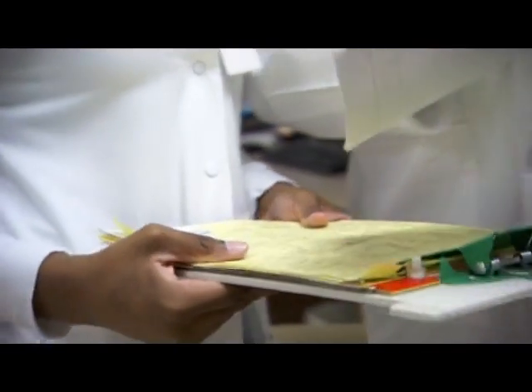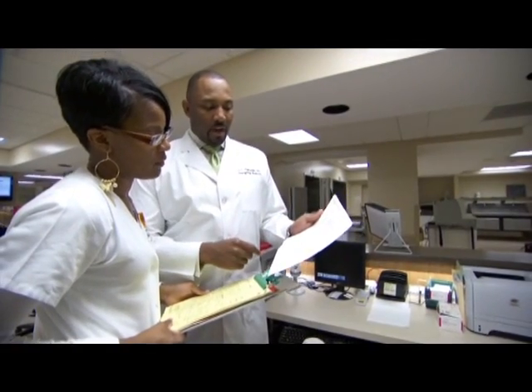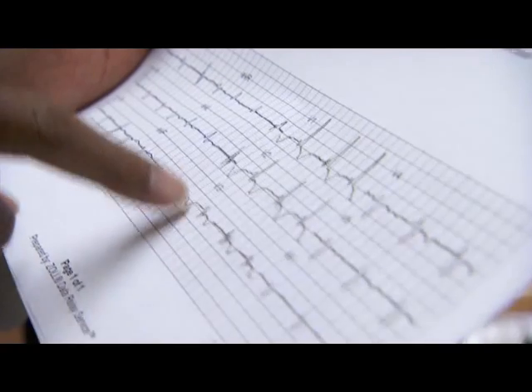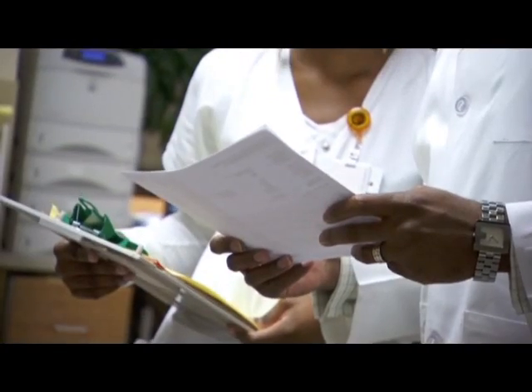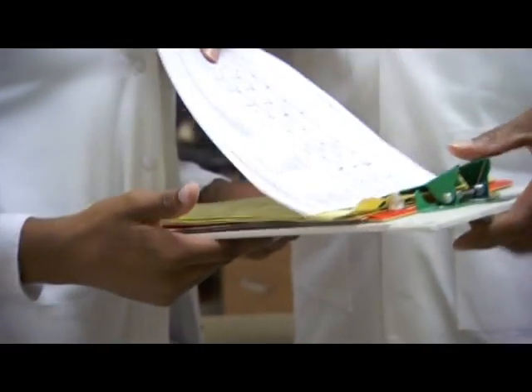As Director of Emergency Services for Baptist Memorial Hospital DeSoto, Dr. Stanley Thompson has worked on the EKG transmission project with the 9 ambulance providers that serve the facility. He says the hospital has cut its time from arrival to treatment to 30 minutes below the national average. That's because important preparations can be made by reviewing EKGs for STEMI patients before they arrive at the ER.